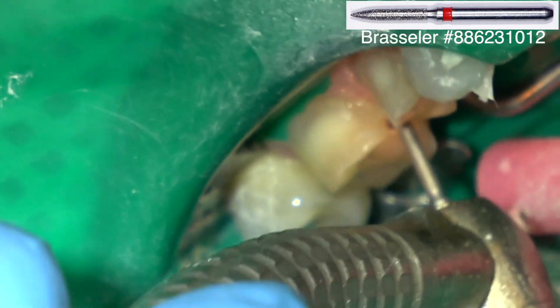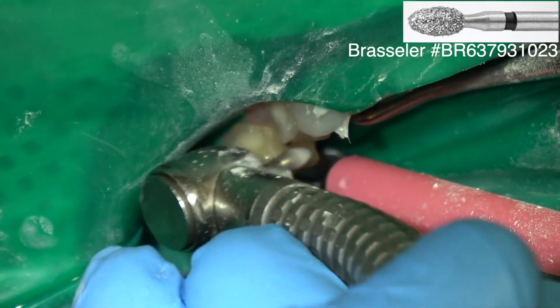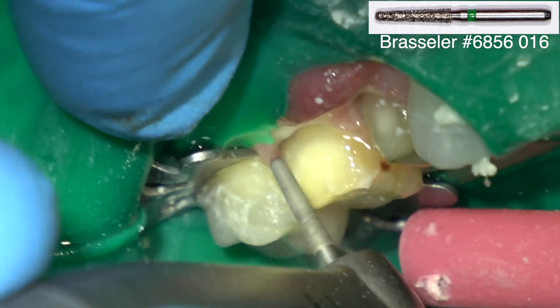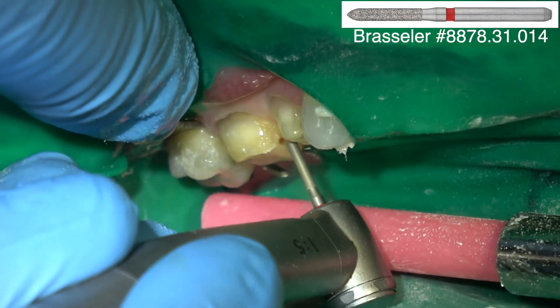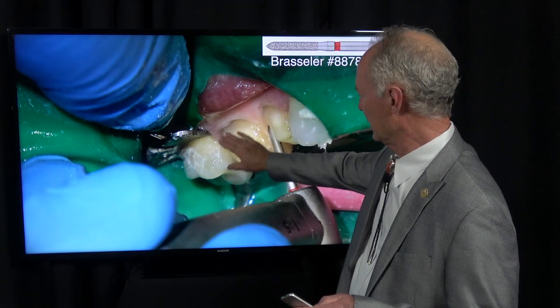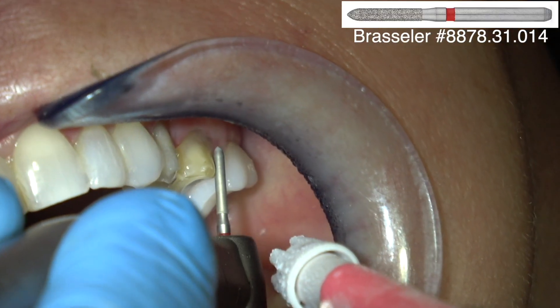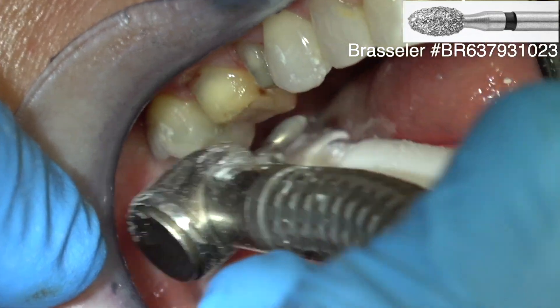You can see some decay on the mesial of that molar. I'm using the coarse football diamond to refine the occlusal aspect of the preparation, then coming back with the coarse barrel diamond to continue the refinement. Just refining the margin with the fine chamfer diamond. I'm not prepping much into the tooth on the facial one-fourth because the patient has pretty much placed the margin through abfractions. Checking the occlusal reduction, rounding the occlusal facial line angles, and the occlusal interproximal and palatal line angles.